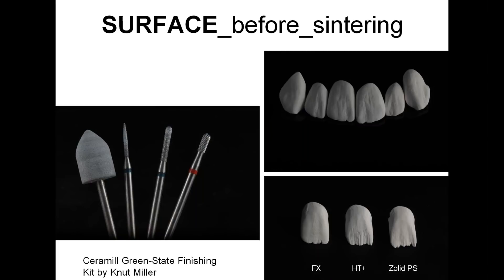Now we are going to focus on processing of the surface in the pre-sintered stage. The Ceramill Green State Finishing Kit by Knut Müller is really all the tools you need. Tool sets number two and three we use to create surface structure on full contour, or to create a mamelon effect on constructions with cutbacks. It depends on the cutback how aggressive your mamelons should look — soft for FX, middle ground for HT+, and most aggressive for Zolid pre-shade. Just keep in mind that after sintering, the crowns are around 30% smaller, so if it looks too aggressive, don't worry.